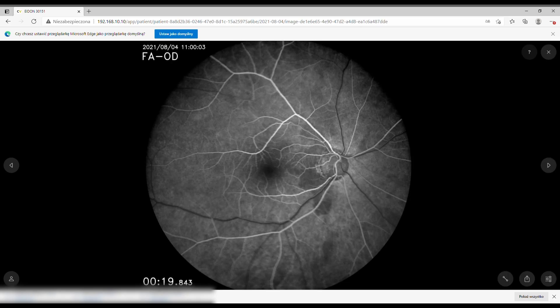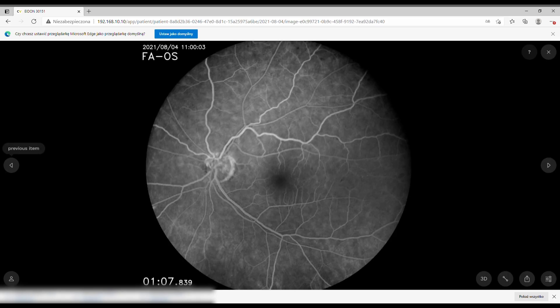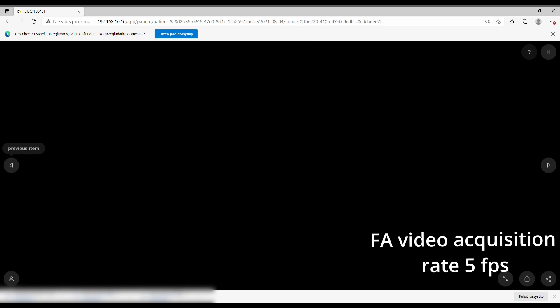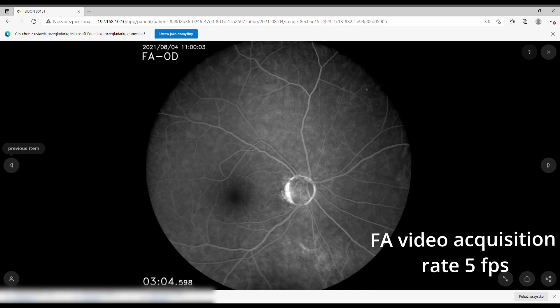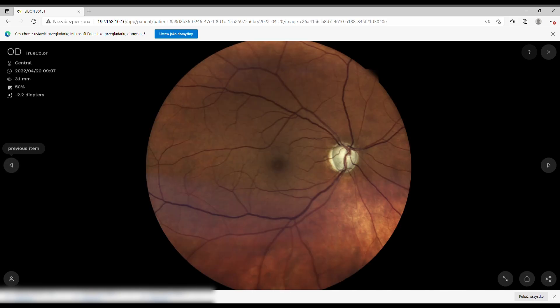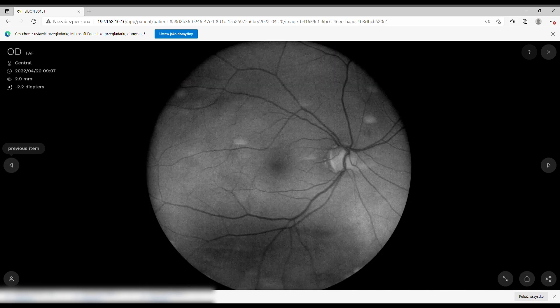This is the fluorescein angiography version, so I'll show a few FA images. This fundus camera has the ability to record movies at five frames per second, like the Spectralis. This is really handy because you don't miss the loading phase.